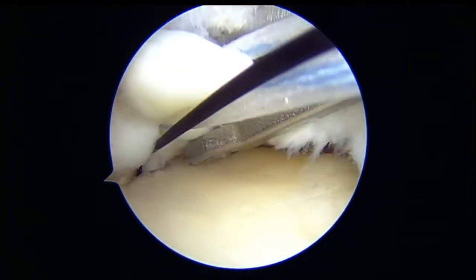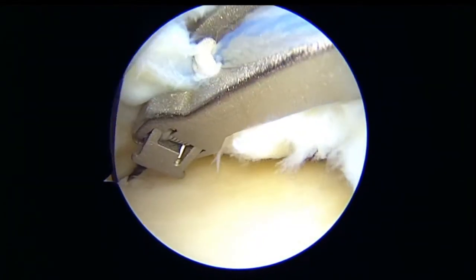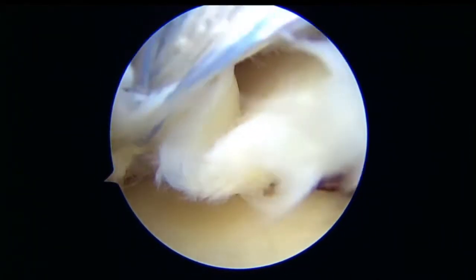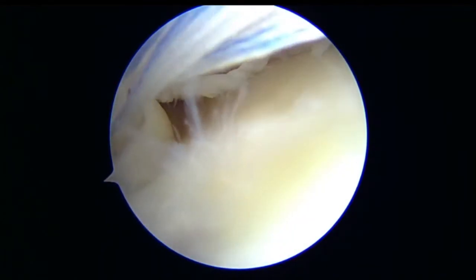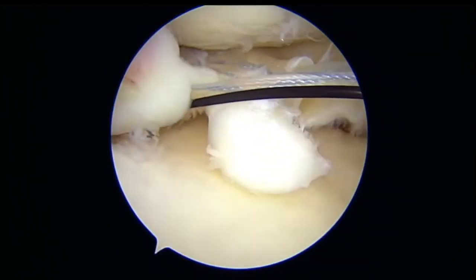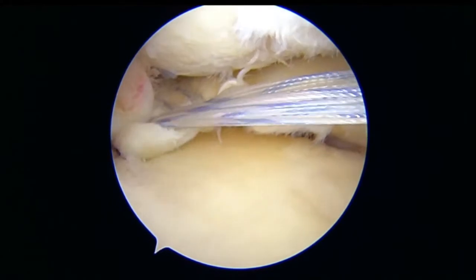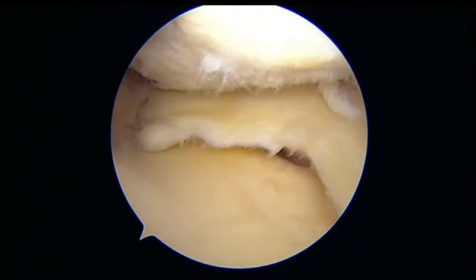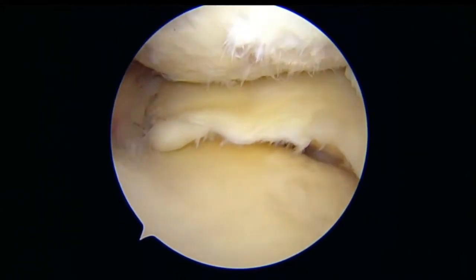We relay it through the shuttle, through the suture, in the tunnel, down on the anteromedial cortex of the tibia and tie it over the suture tape over the titanium endobutton. There you can see nice compression of the root back in place.